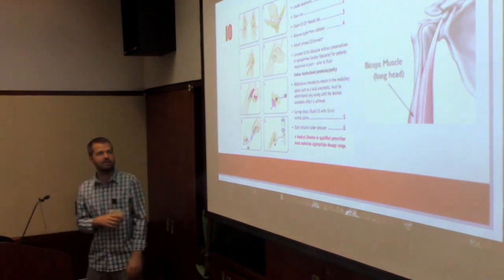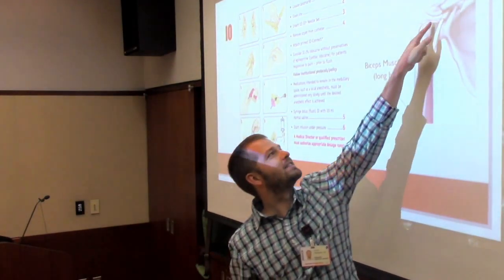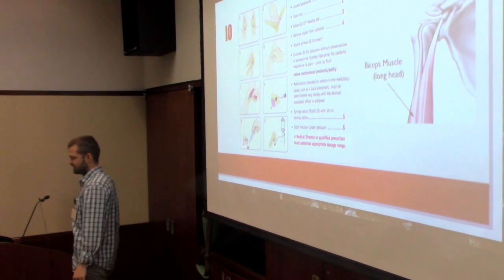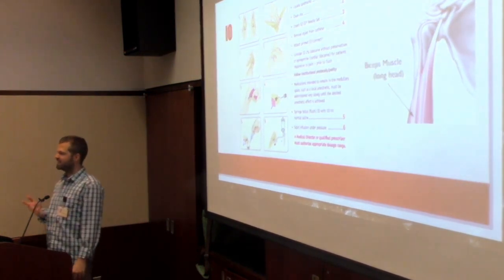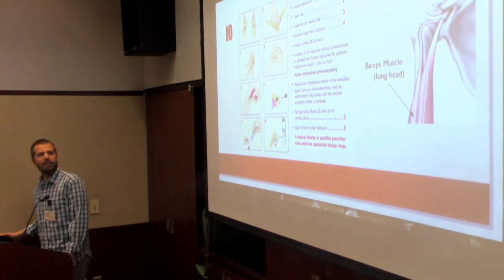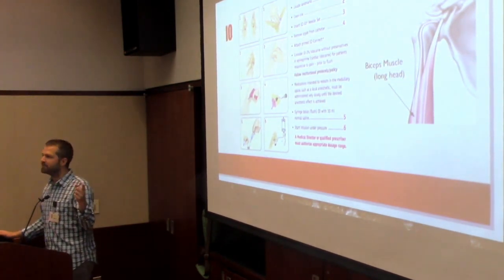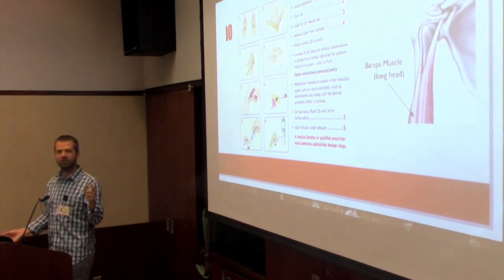And the other thing is, can anyone tell me what this guy is? Riding around a little curve. I'll give you a hint, it's related to the biceps muscle. Some sort of tendon looking thing. So apparently people actually drill into this all the time and sever it. And I didn't know that until the IO people were like showing me how to do it.